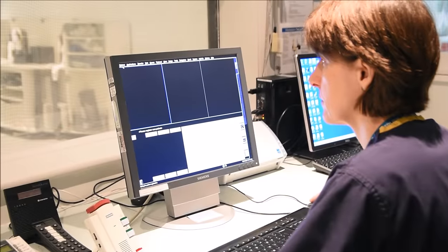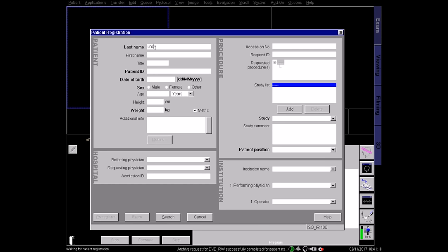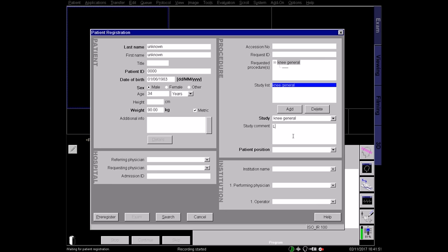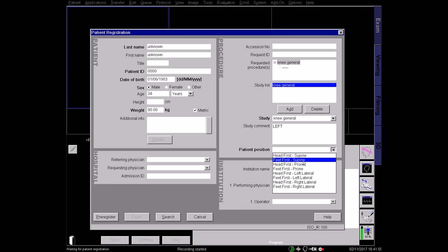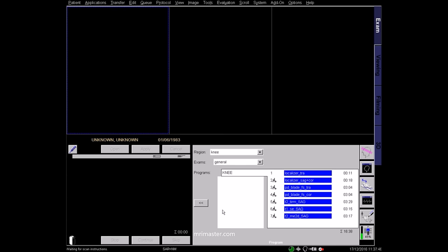Once you are back in the control room, select the correct patient details in the browser, or type them in manually if necessary. It is very important to get the details right, including the correct patient weight, so that the SAR can be calculated accurately. Register the patient as lying feet first and supine. Choose the appropriate knee protocol according to your hospital and radiologist guidelines.